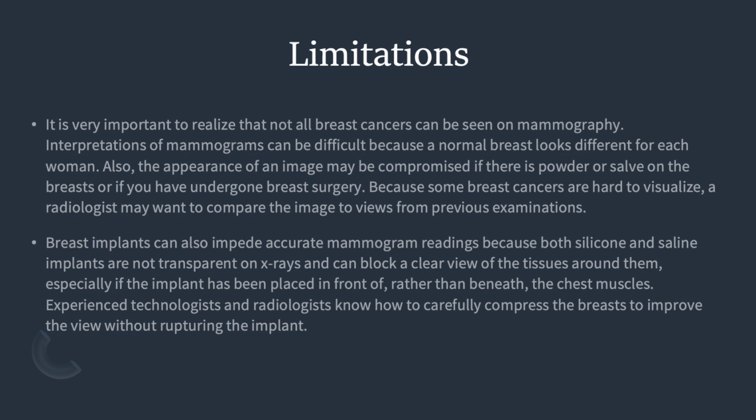Because some breast cancers are hard to visualize, a radiologist may want to compare the image to views from previous examinations. Breast implants can also impede accurate mammogram readings because both silicone and saline implants are not transparent on X-ray and can block a clear view of the tissues around them, especially if the implant has been placed in front of rather than beneath the chest muscles. Experienced technologists and radiologists know how to carefully compress the breast to improve the view without rupturing the implants.